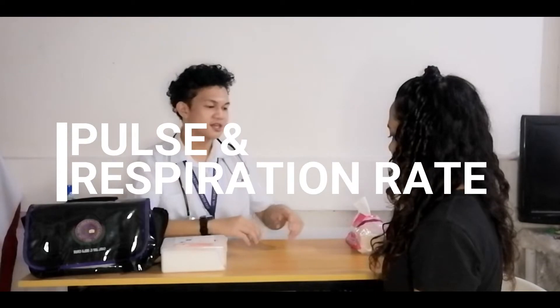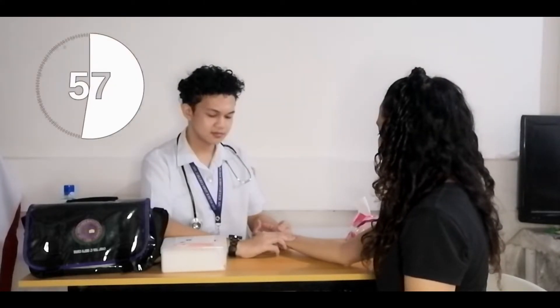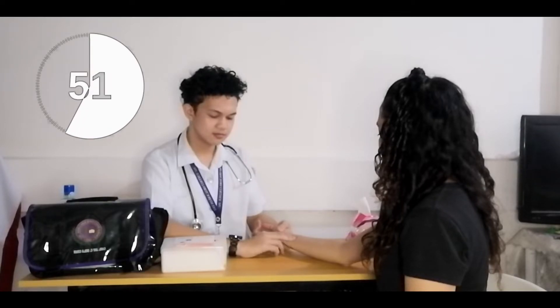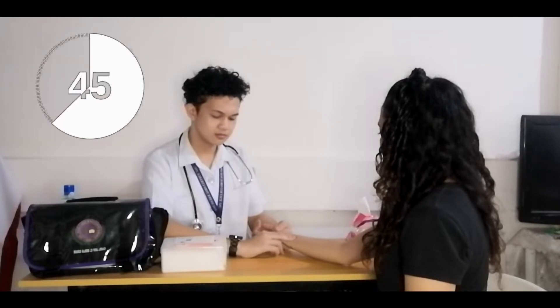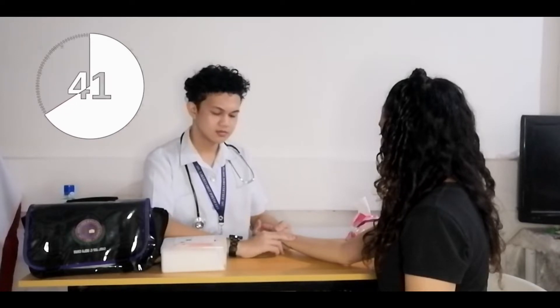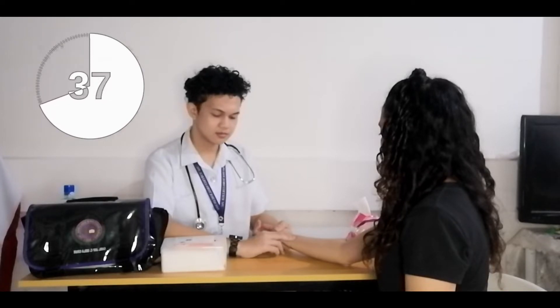Alright, this time I'll be checking for your pulse rate. May I have your hand please? Just relax. While waiting for the thermometer to go off on her axilla, for a whole minute, I am simultaneously counting for both pulse and respiration rate of the patient. It is important that I don't inform the patient that I am counting for her respiration rate, or else she might alter her breathing and I won't be able to accurately document her vital signs.